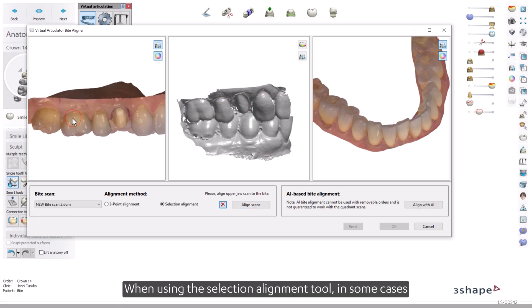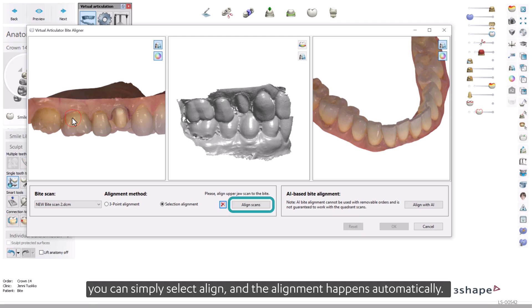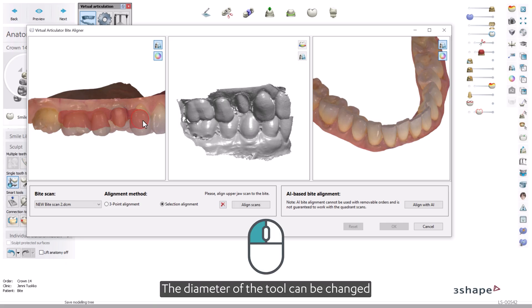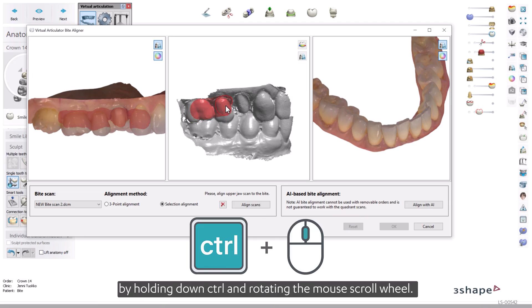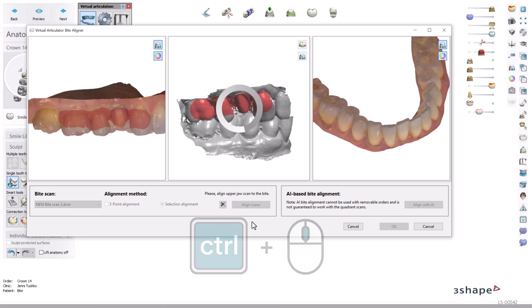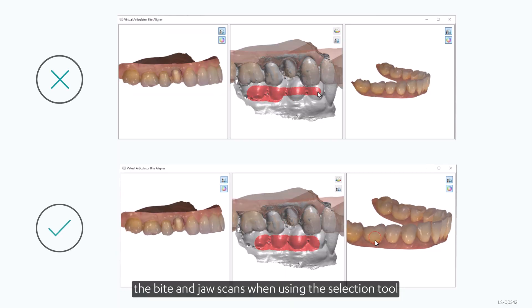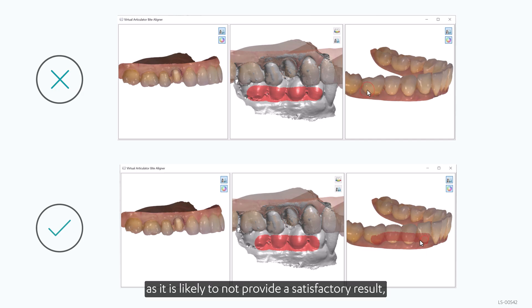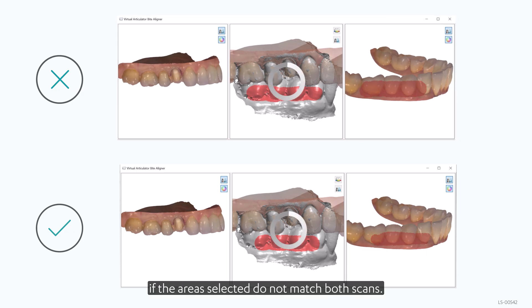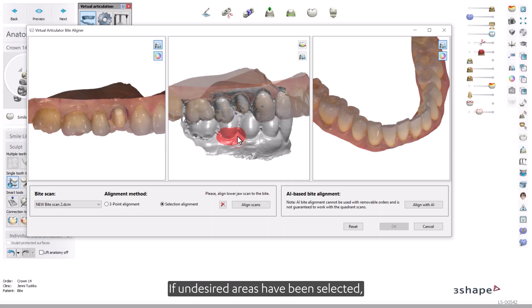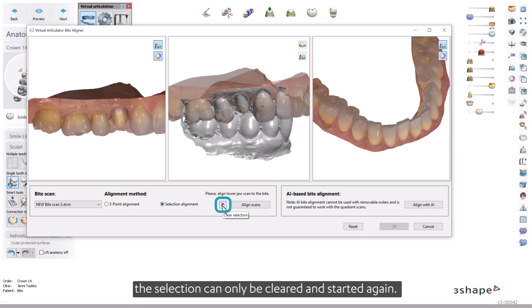When using the Selection Alignment tool, in some cases you can simply select Align and the alignment happens automatically. If this does not produce the desired outcome, you have the option to paint select areas by holding down the left mouse button. The diameter of the tool can be changed by holding down Control and rotating the mouse scroll wheel. Make sure to select only areas that are present in both the byte and jaw scans, as it is likely to not provide a satisfactory result if the areas selected do not match both scans. If undesired areas have been selected, the selection can only be cleared and started again.